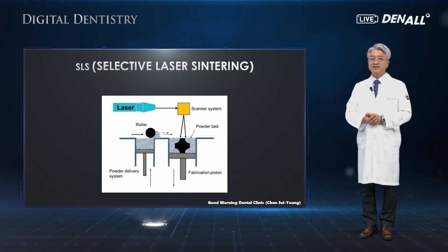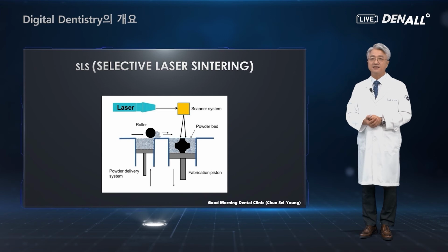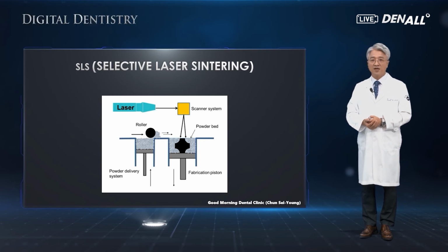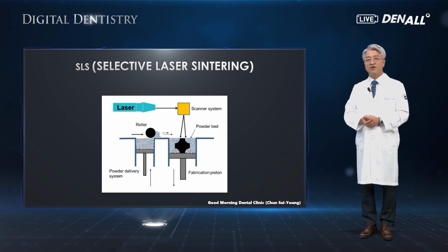We talked about resin printers quite a lot. One more material used a lot in dental offices is the metal materials. So there has been a lot of discussion whether 3D printing can be used for metal printing from the past. Laser is used in the industry to print metal powder. It is adopted and used in dental offices.